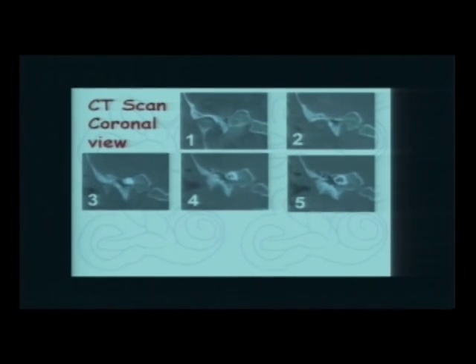Nadaha is something from us, okay? In nadaha, when you look inside the middle ear, you find that the round window is concealed by the round window niche. Sometimes you can't really see it nicely. But then you see this very nice hypotympanic air cell, and your eye goes to it, and it's calling on you, come here, I am the round window. Start drilling me out and put your electrode here. Don't look up there. Up there, this is not the round window. This is what we call nadaha, because it takes you in the wrong direction. Okay? So always be careful of this air cell tract, which is present inferior to the cochlea.